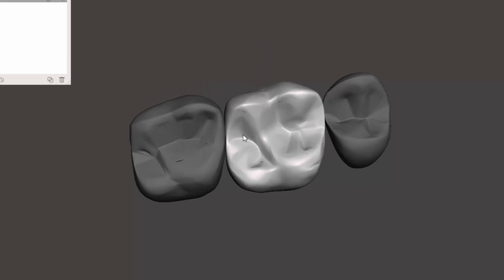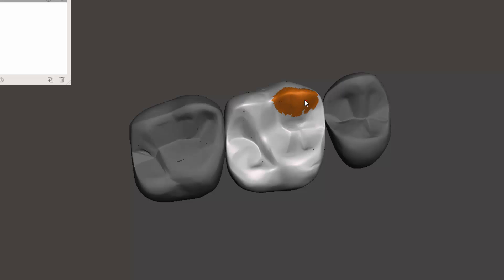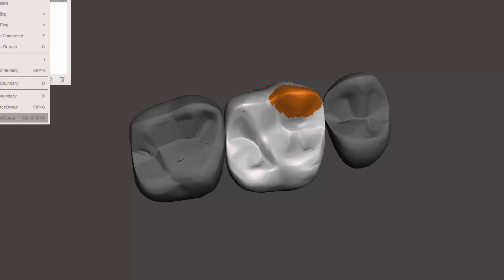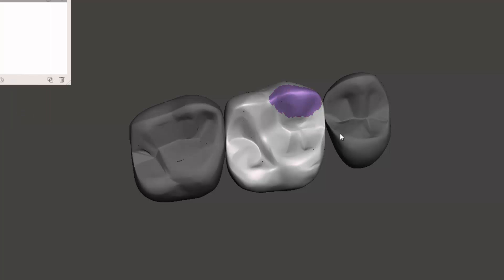What I'm going to do is I'm going to hit S for select, and I'm going to change this brush size to around 50 or so, and I'm going to just essentially highlight the cusp. Then you can go over here to create face group or just hit Control+G, and that's going to create a unique surface.